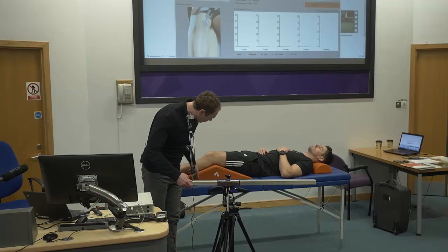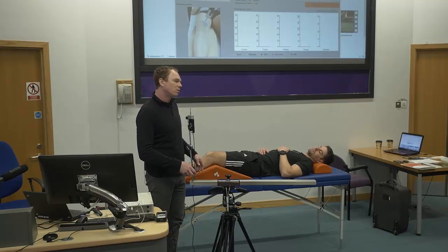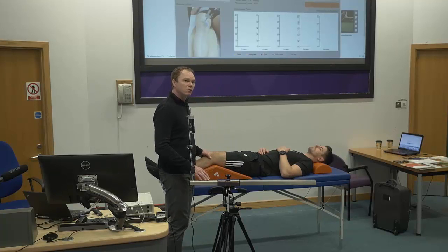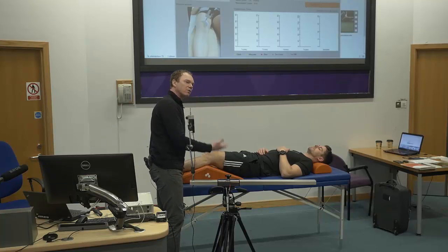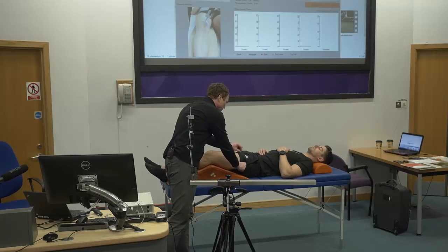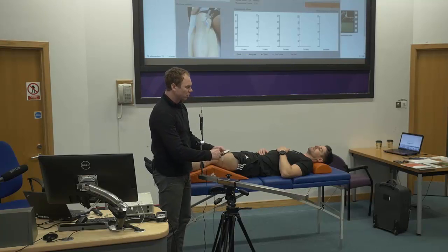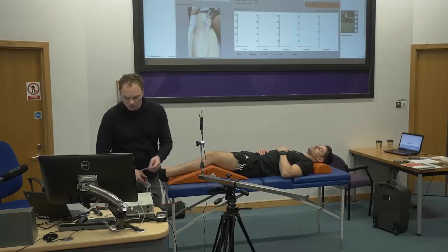As soon as you do that, you try to make the subject in a position where the muscles you are measuring are really relaxed. The second thing you need to do is position the electrodes over the muscle belly you will measure. We'll switch legs so you can see a little bit more — we'll measure the medial head so you'll understand where to position the electrodes before the measurement.